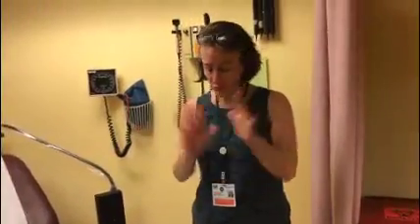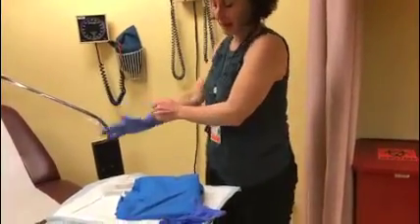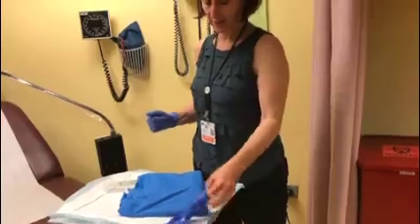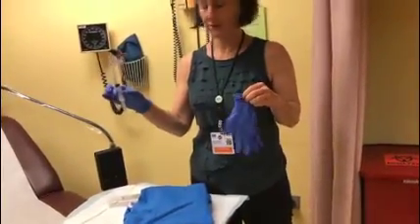I washed my hands, dried them, and I'm putting on some gloves. At the Institute, we have a package that includes most of our supplies for the IUD insertion. Separately, we have a syringe with some lidocaine.